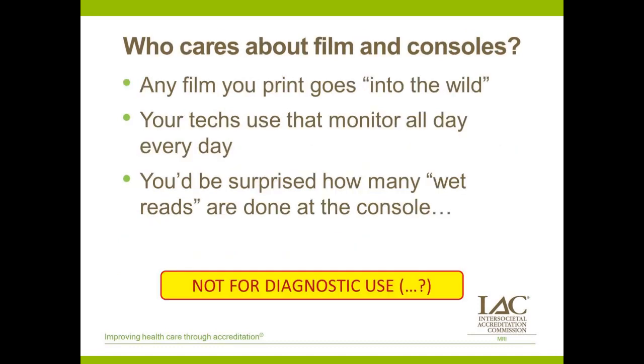You might have noticed in the list of tests earlier that we are interested in seeing QA of the monitors and printing devices. You might say, well, who cares, right? We put stickers on our films that say not for diagnostic use. Maybe I'm showing my mammography roots again. So just remember, if you are still printing film, and I see we have 96 people on the line, so statistically not one of you is doing that.